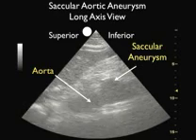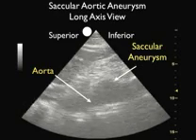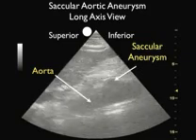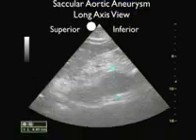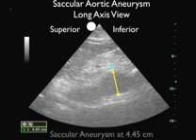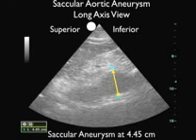the anterior wall there. Interestingly enough, this patient presented with epigastric abdominal pain, and at first we thought she only had gastritis. When we actually put the calipers down and measured this abdominal aortic aneurysm, we can see here that the calipers come up with a measurement of 4.4 centimeters, fulfilling the criteria of a AAA greater than 3 centimeters.